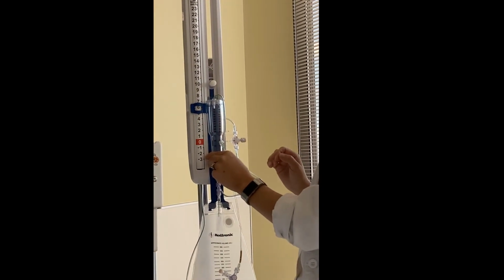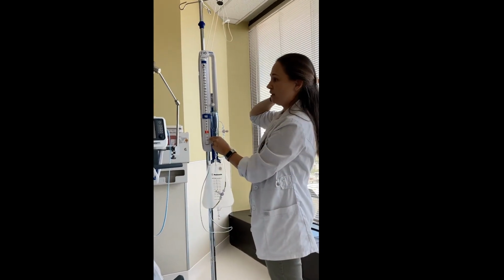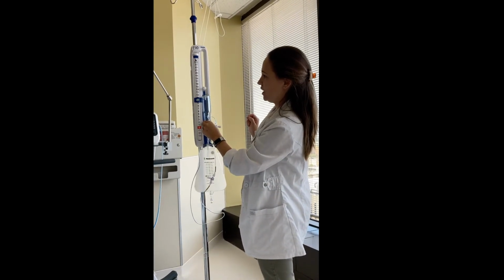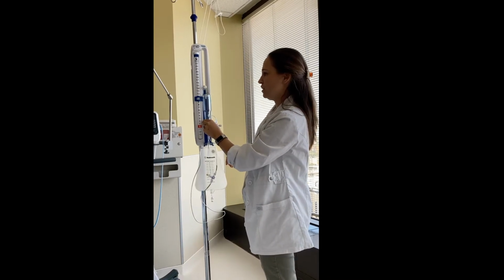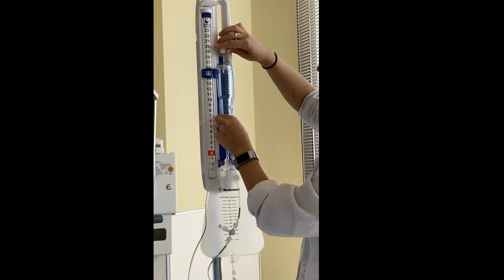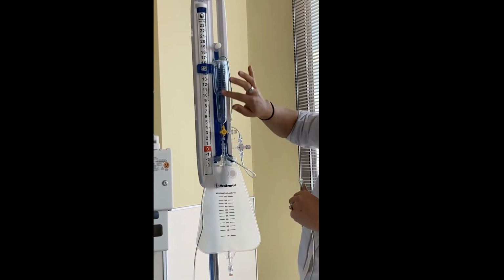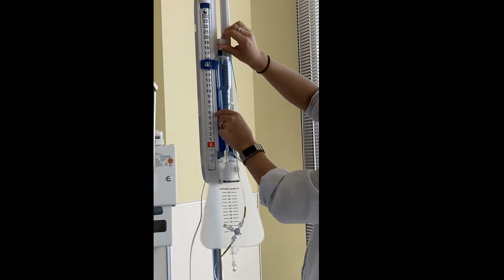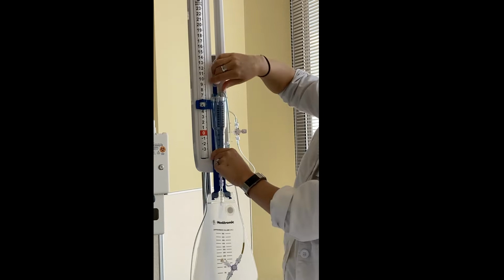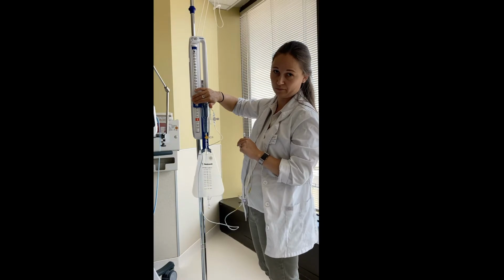Normally, ICP values are from 0 to 15 millimeters mercury, and the neurology team will tell you where to start your drainage chamber. For example, if you don't want your ICP to go over 15, you will set this chamber here, and once the ICP in the brain, in the ventricles, reaches 15 millimeters mercury or higher, you will see some drainage here. Alternatively, they might tell you to start it at 5, so you would start it here, and then you would start draining cerebrospinal fluid as soon as ICP in the brain reaches 5.